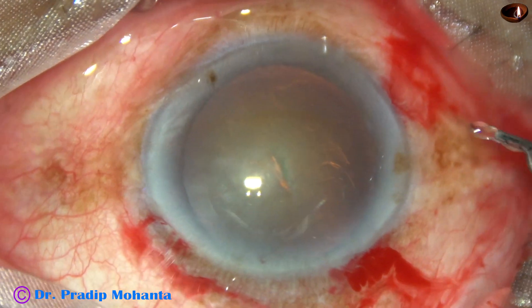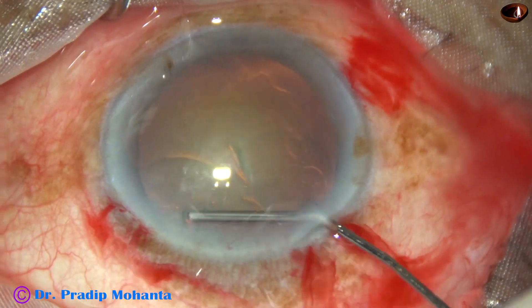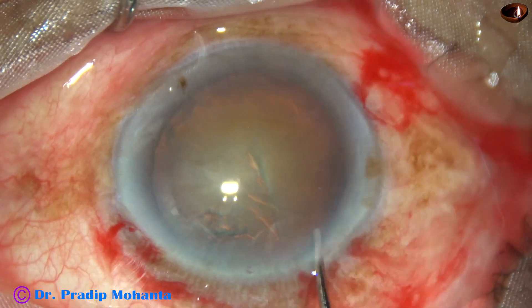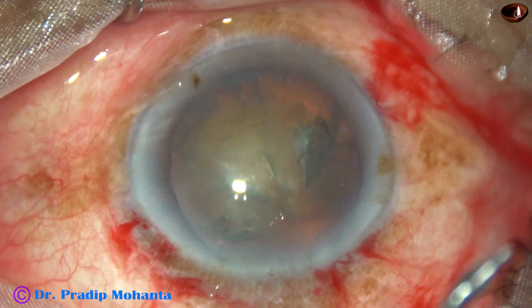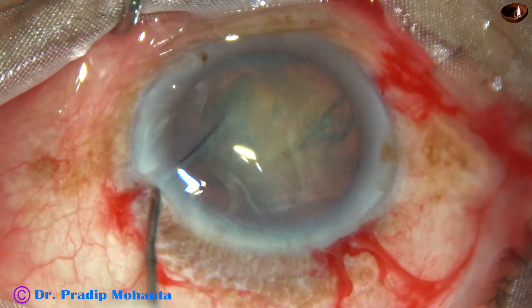And now hydrodissection — 27-gauge cannula with BSS. The fluid wave is passed under the anterior capsular rim, goes to the opposite equator, the nucleus is depressed, and the fluid wave comes anteriorly along the equator. The nucleus is mobilized and rotated.